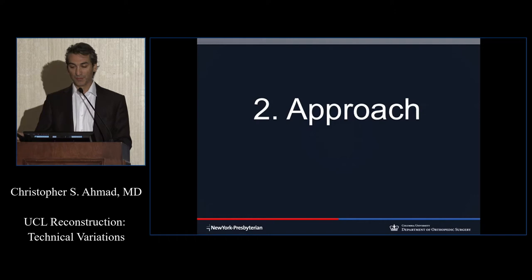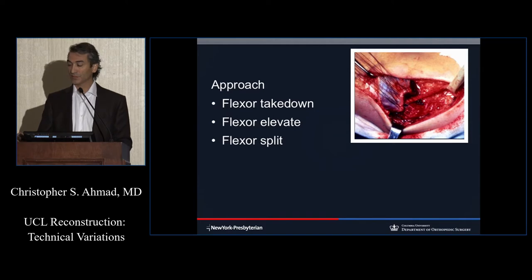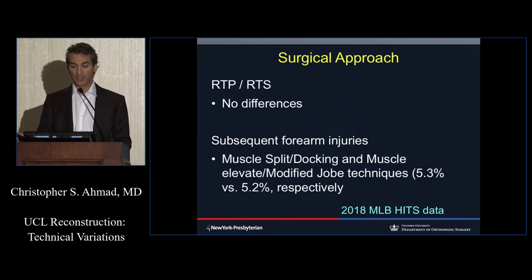Okay, let's talk about approach. How do we get to the ligament? There's differences. You can take the tendon down. That's historical. We don't really do that anymore. This is a picture of Dr. Jobe's technique. Look at all the sutures trying to put that thing back. As we showed in the anatomy video, you can elevate it. Dr. Andrews popularized that, or you can split it, and we showed that in the video.